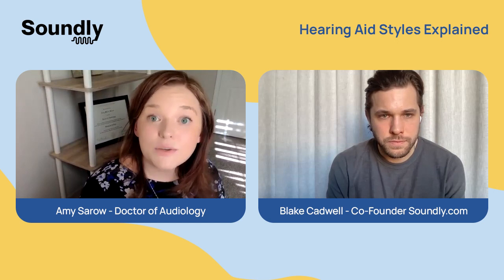And those are going to be best for people with sensory neural hearing loss, and they would have to go through an evaluation. And we've talked about this recently in another video about what to consider if you're thinking about cochlear implants. Yeah, and cochlear implants often are for those who can no longer receive benefit from hearing aids. So typically someone who has more severe hearing loss, and we will link that video in the show notes.